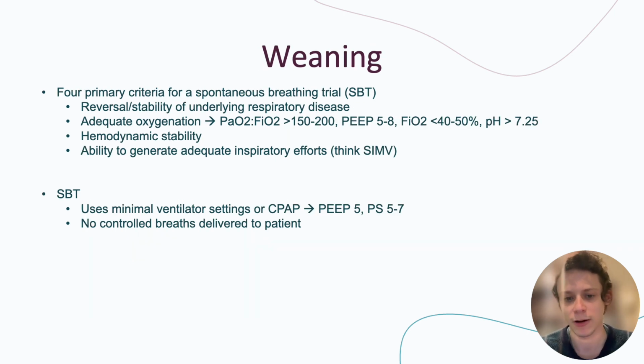So we just spoke about how SIMV is a bridge to extubation. So how is the weaning process actually done? Once a patient's on SIMV and it's determined that they can move to something called a spontaneous breathing trial, they need to meet 4 criteria. The 4 criteria are as follows.